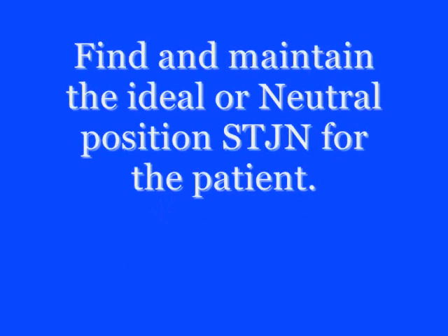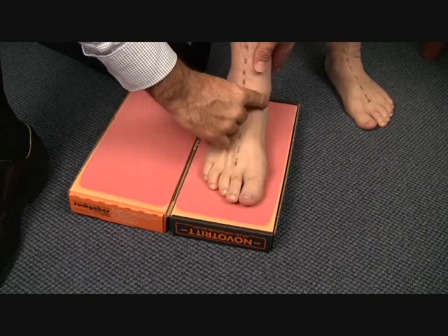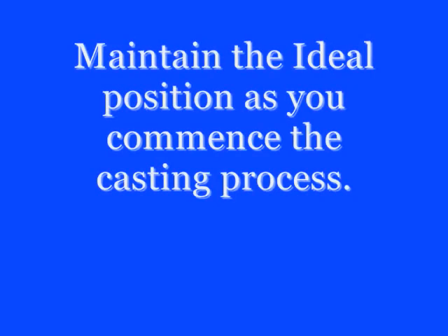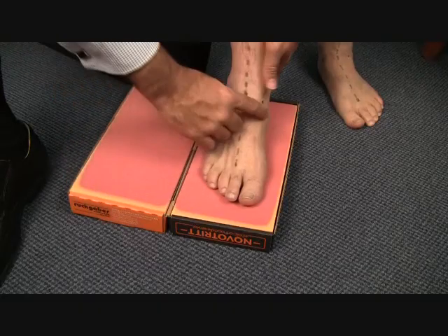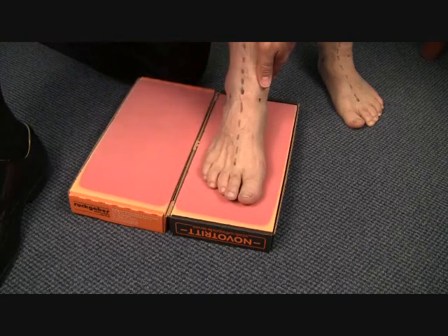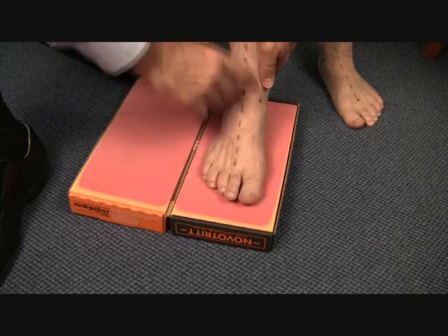Position the patient's knee underneath your arm and control the lower one third of the tibia with your hand. Position the foot into subtalar joint neutral by using both the ICB ALM and the talonavicular reference points. During the casting procedure, continue to check the ideal subtalar joint neutral position, maintaining the line in the correct position and checking talonavicular reference points.